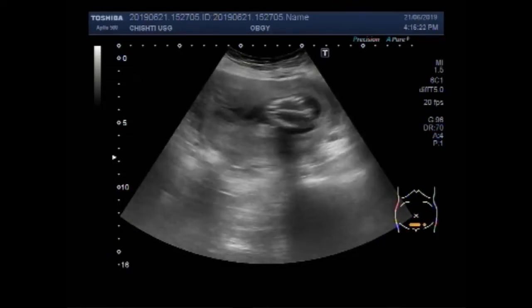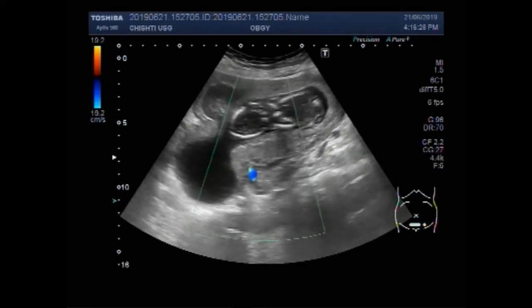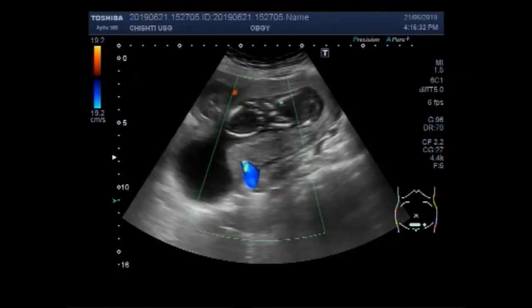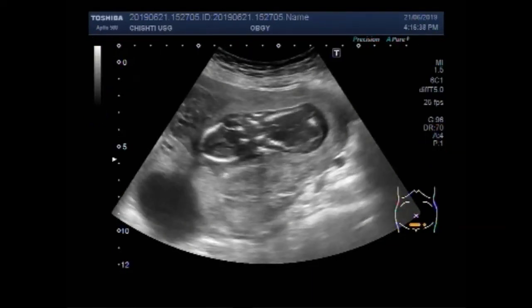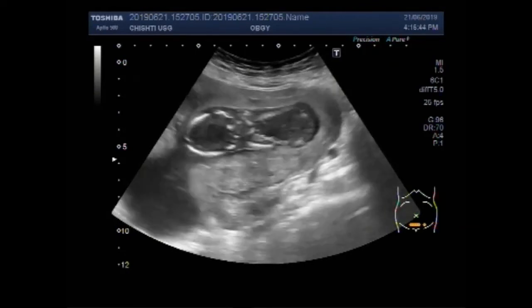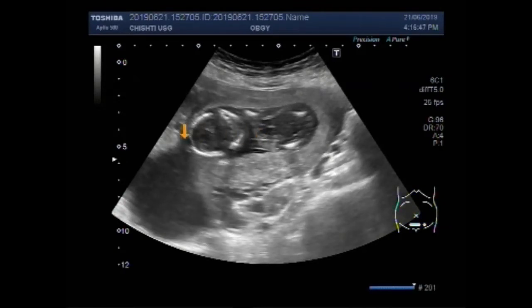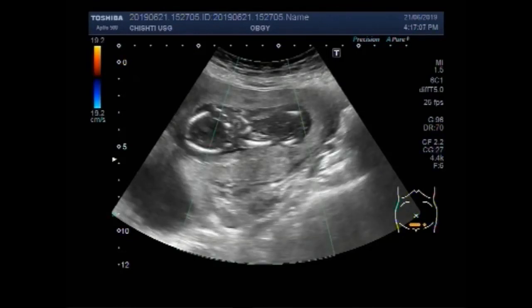Now you can see there is no blood flow seen inside the fetus. No cardiac activity is seen. This is the fetal head and you can see a little fetal edema on the fetal head. This is the fetal heart, which is not beating. No blood flow is seen in the fetus.